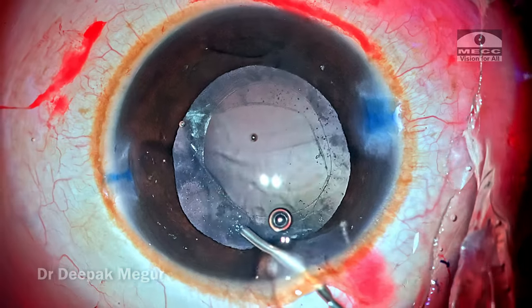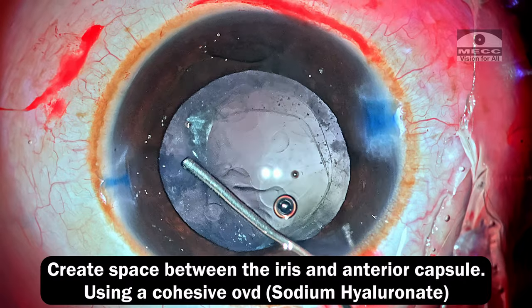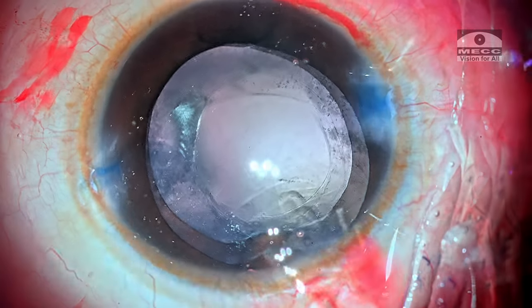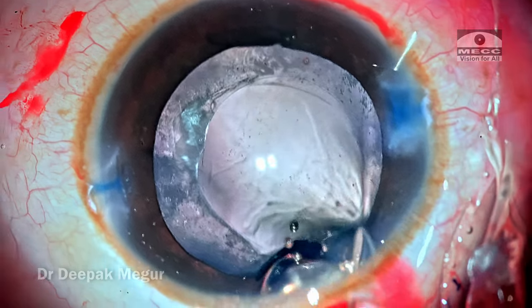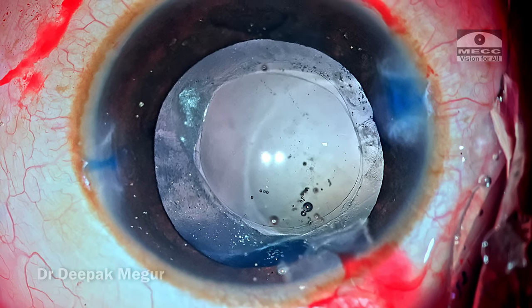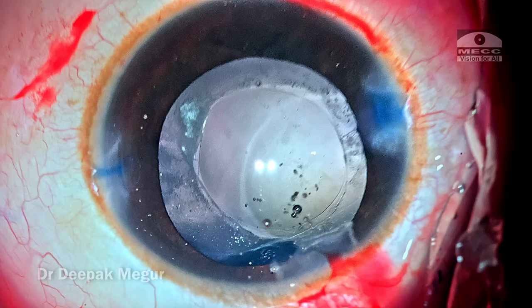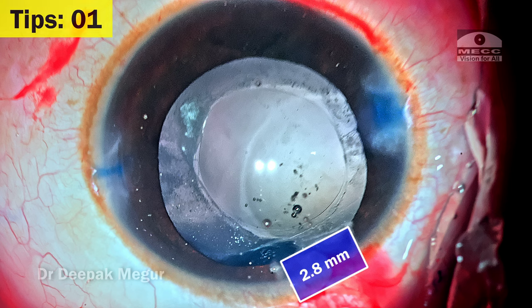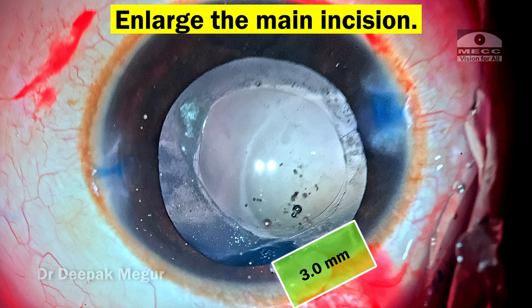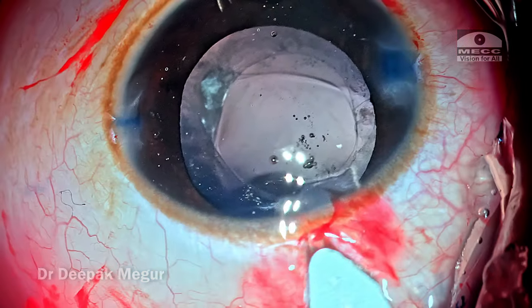Now is the time to implant the lens. Cohesive OVD is used to create space behind the iris and above the anterior capsule. In these post-vitrectomy eyes, especially a child's eye with very low scleral rigidity, the eye is going to be extremely soft — making it very difficult to negotiate a foldable IOL through a 2.8 mm incision. One important tip: I always prefer to enlarge the main incision from 2.8 to about 3.0 mm so it allows easier insertion of the cartridge through the wound.